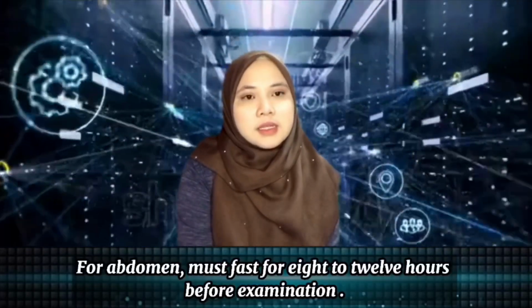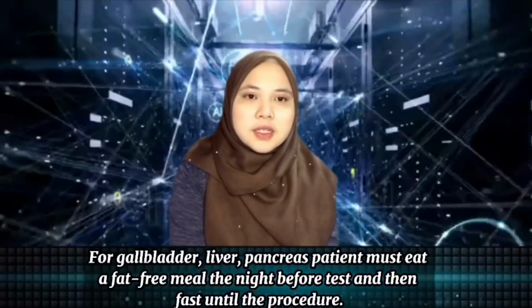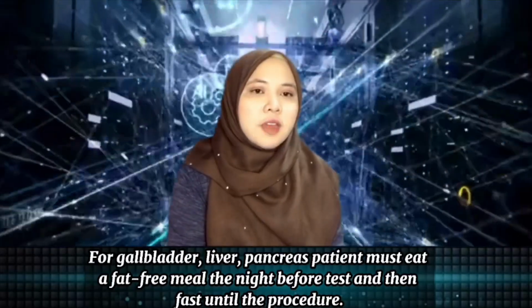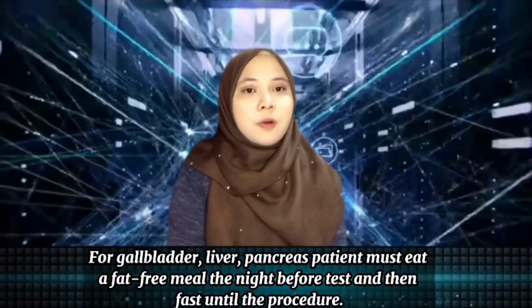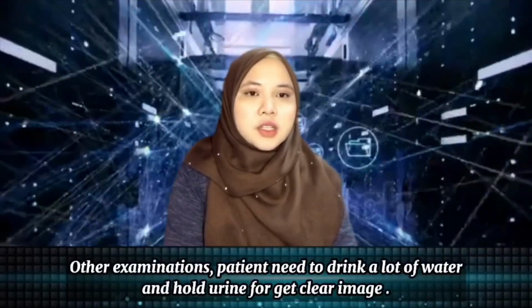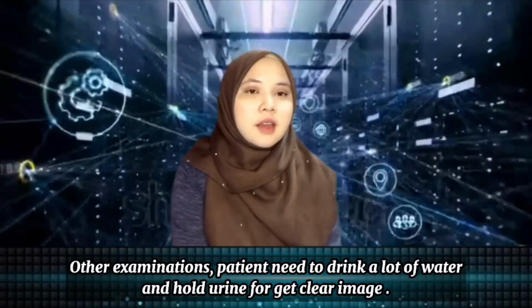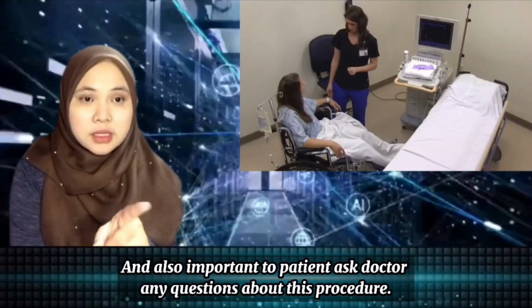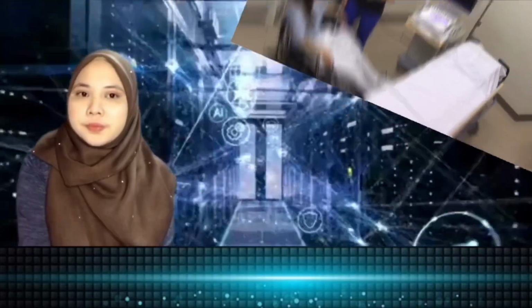For the abdomen, the patient must fast for 8 to 12 hours before examination. For the gallbladder, liver and pancreas, the patient must eat a fat-free meal the night before the test and then fast until the procedure. For other examinations, the patient needs to drink a lot of water and hold the urine to get a clear image. And also important, the patient should ask the doctor any questions about this procedure.